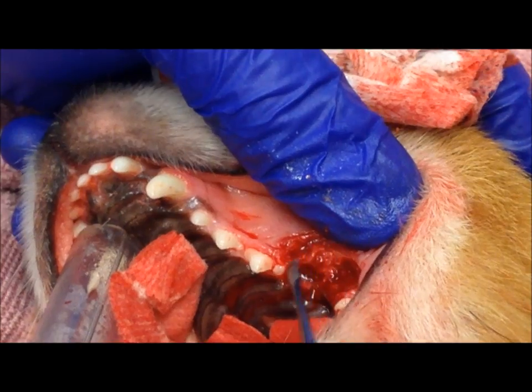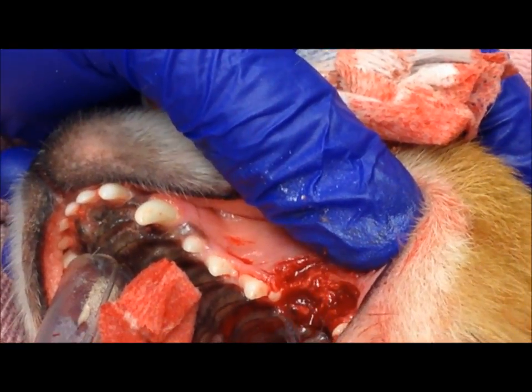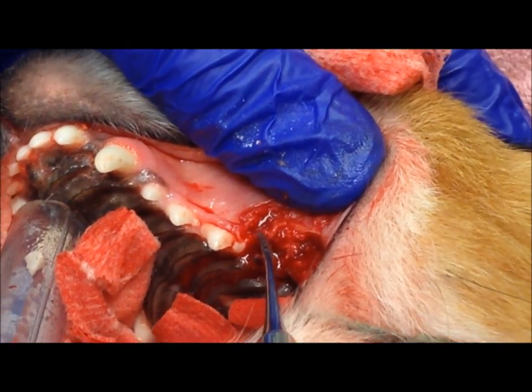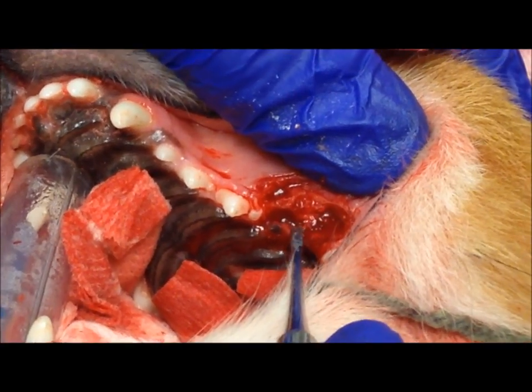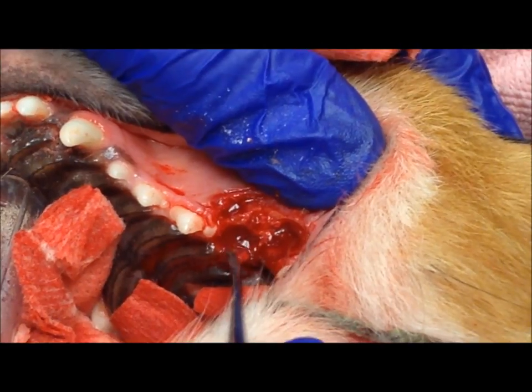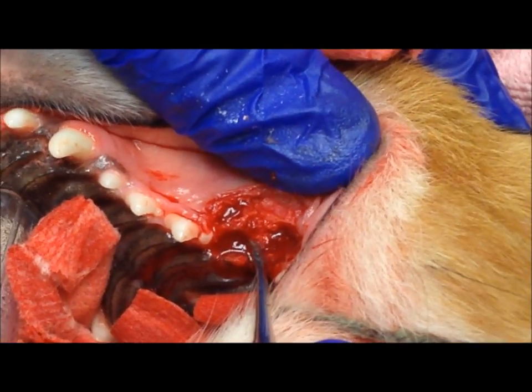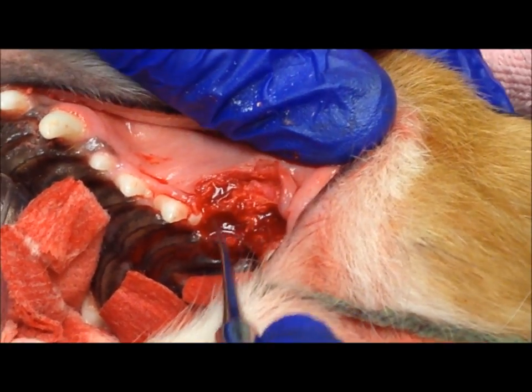I've smoothed out some of this bone here so it's not jagged and won't cut through the gum as we close it. You can easily see where the three roots were: the mesial buccal root, the mesial palatal root, and the distal root. We try not to disrupt the blood clot that forms in there because that's an important part of the healing process. The next step is going to be to suture this flap of gum tissue over the defect.